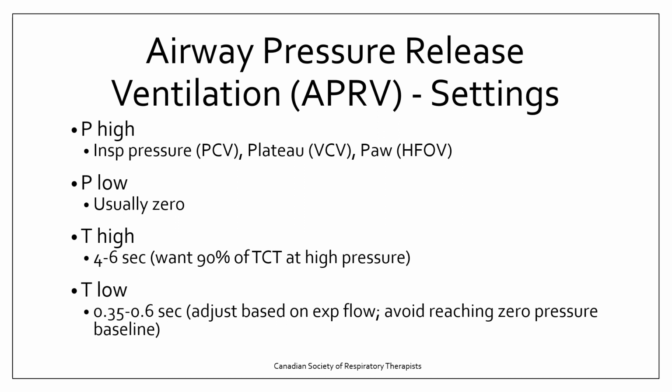That's sort of the whole goal, is to have our time so short that when the patient is exhaling, when that pressure is released and they're in that quote-unquote exhalation phase, going from high pressure to low pressure and dumping their CO2 out, they never actually reach that 0 baseline, and then they go right back up to that high pressure. So if we're looking at it, it would kind of look like this.